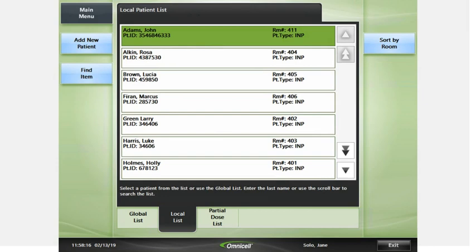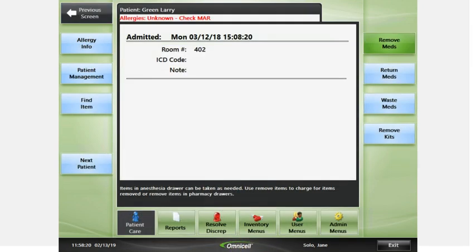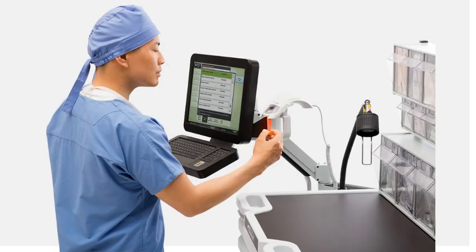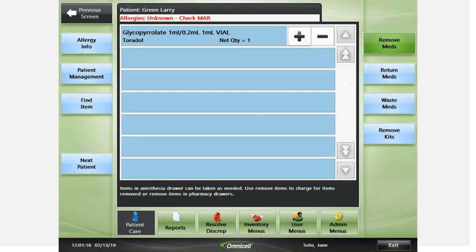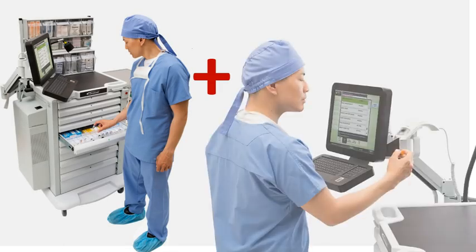If the patient is not on this list, press the Global List tab and search for the patient there. From the patient screen, remove the item from an anesthesia drawer and scan the item barcode. Once scanned, the item is added to the top of the list with a quantity of 1. Remain on the blue issued item list to scan items. To remove additional quantity of the same item, press the plus sign next to that item. To remove a different item, open the drawer, remove the item, and scan the item barcode.